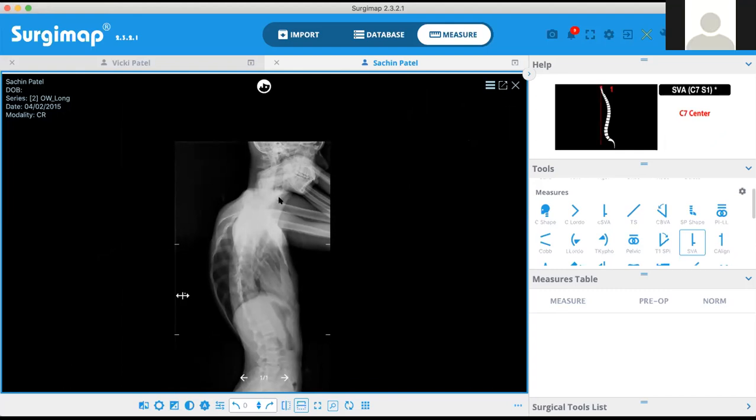So now what we have kind of moved over to, we ask them to hold the ears now. Hold the opposite ear. So that's what we do. Or hold the opposite ear behind the back, so the PT becomes clearer. We're trying it out. For all the lateral x-rays, instead of in the front, you ask them to hold the opposite ear across the head. But Ranjit, does it make it a bit more clear, T5 and all this?